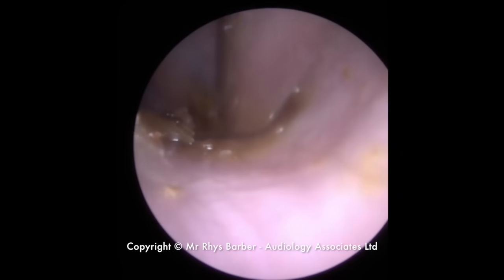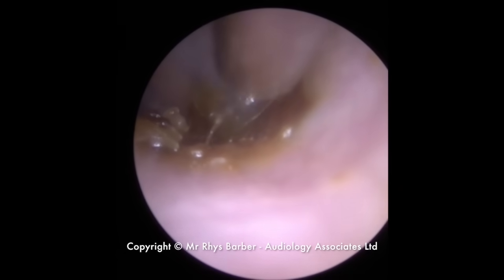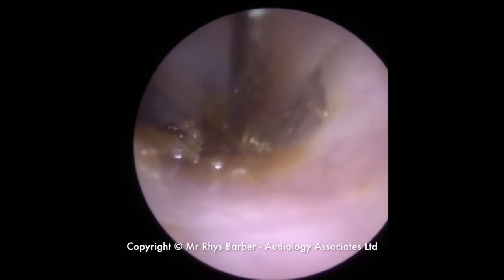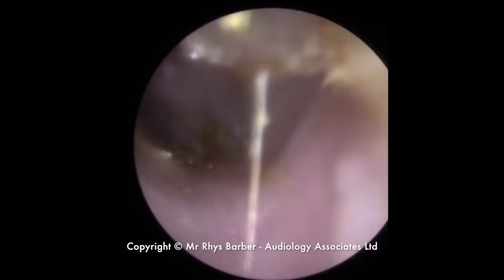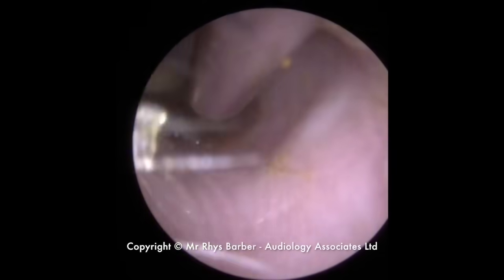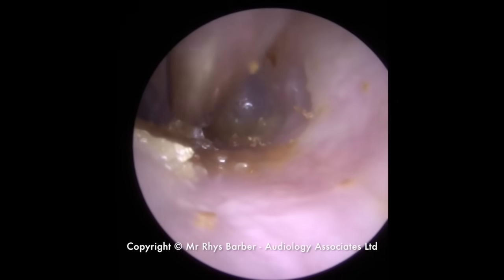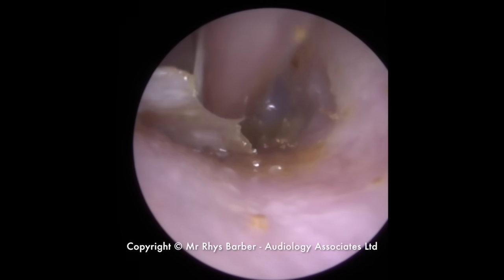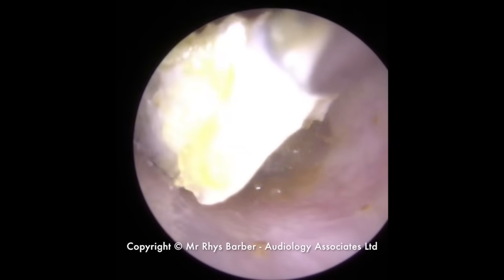So this is the fine end again. Just looking to try and get a grip. Obviously you've got to be very careful, just hovering above the ear canal wall there because we know it's very sensitive. Just going in for the next section now. There we go, we've got a long kind of — there's that skin, the remainder of it.